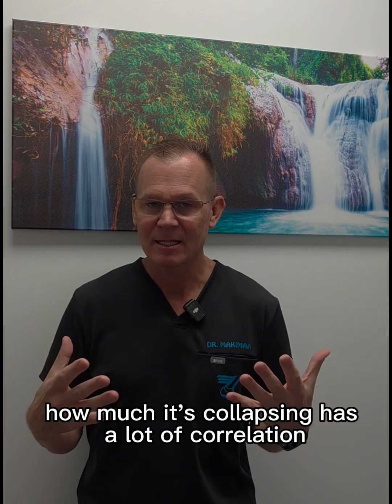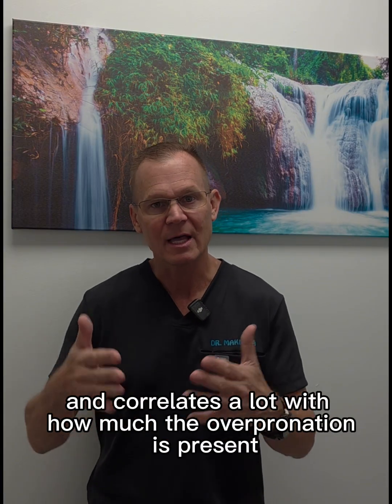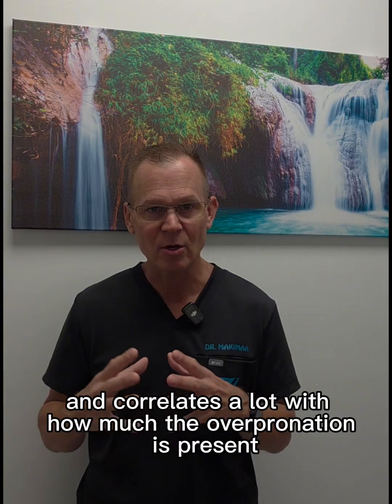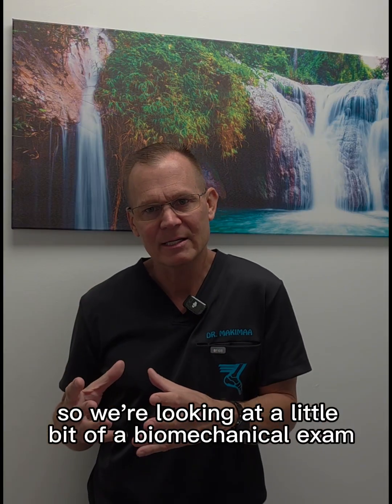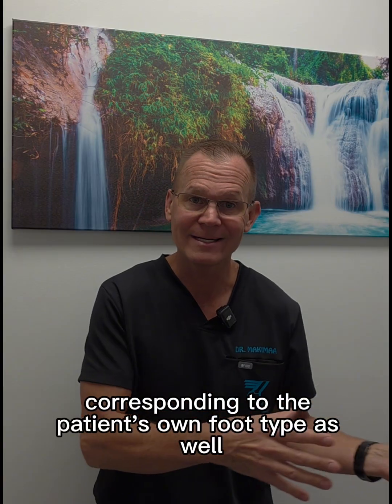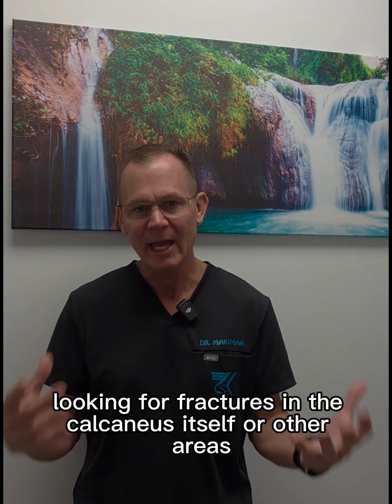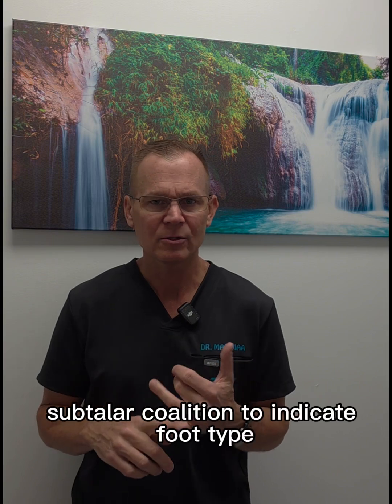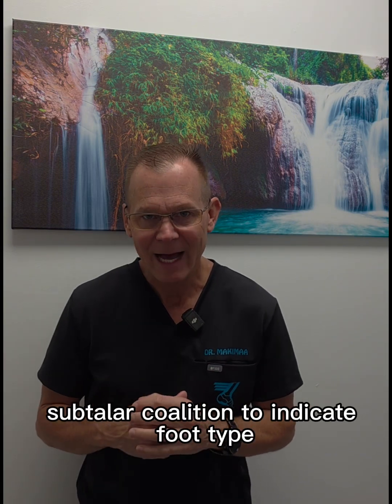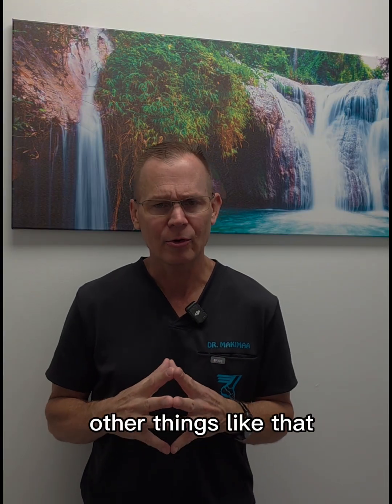We're going to look at the mid-tarsal arch, how much it's collapsing, has a lot of correlation to how much stress is being put on the plantar fascia and correlates a lot with how much the overpronation is present. So we're looking at a little bit of a biomechanical exam by looking at the X-ray, of course, corresponding to the patient's own foot type as well. Also, of course, looking for fractures in the spur itself, looking for fractures in the calcaneus itself or other areas. Subtalar coalition to indicate foot type. Also bone density, an obvious bone tumor, other things like that.